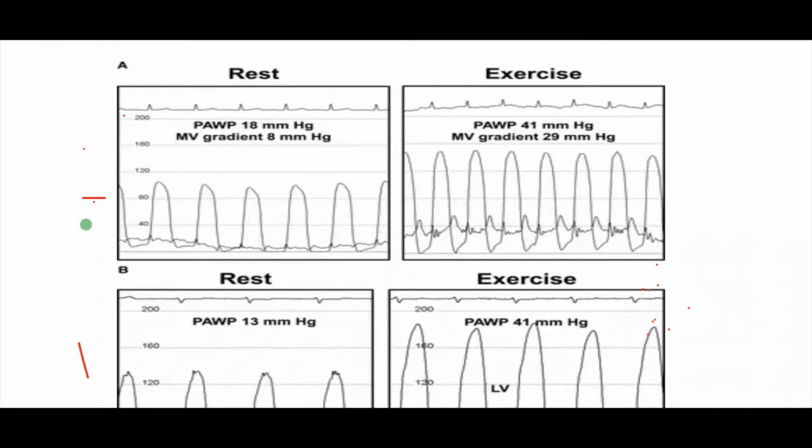So what's your final analysis? What is your final analysis here? Severe mitral stenosis. Exactly. Now, I am going to ask you a question. This patient was symptomatic, and at baseline, we failed to elicit data to support severe stenosis, but at exercise, hemodynamics are clearly in keeping with severe mitral stenosis. What are you going to do to this patient in terms of management?